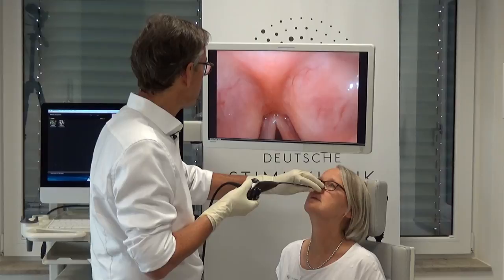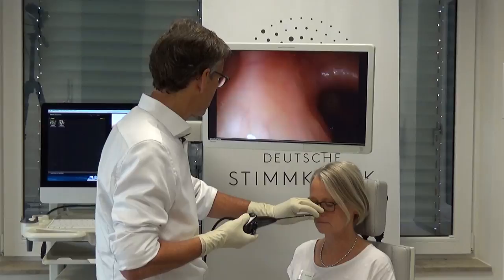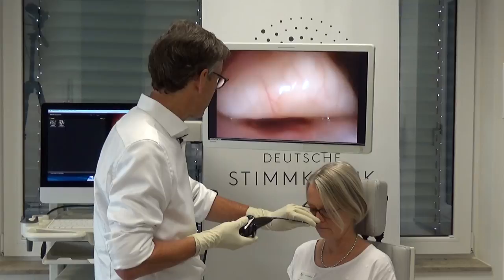Exhale — isn't that a beautiful view onto the laryngeal aspect of the epiglottis. Now let's see what happens when you flex your neck all the way down and give me a long inspiration.